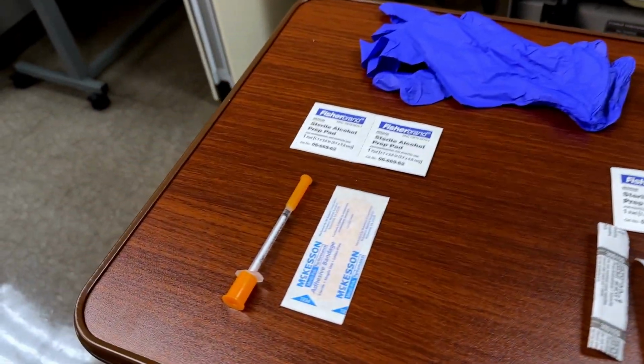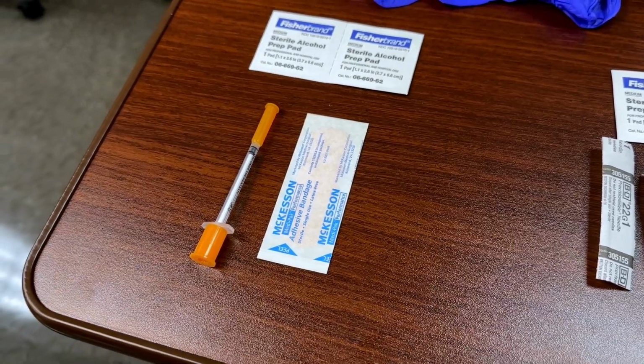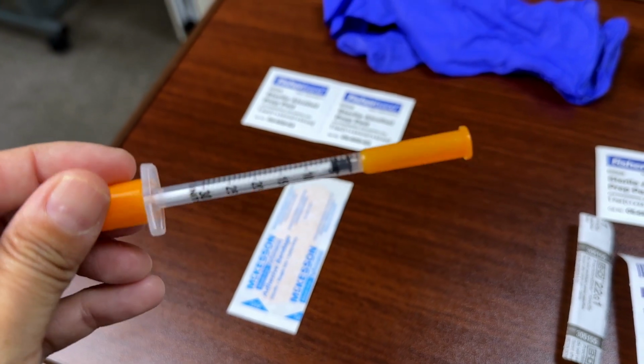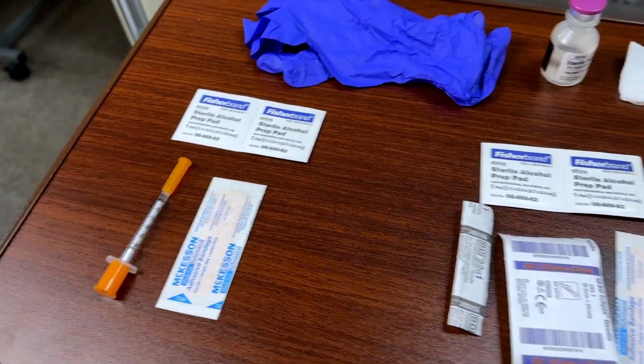So here on this side we have the alcohol prep pads, and we have an insulin syringe. So you'll see that it's really small. The syringe is really small, and it's marked in units. So that is for administering insulin. That's a subcutaneous injection. We also have a Band-Aid.